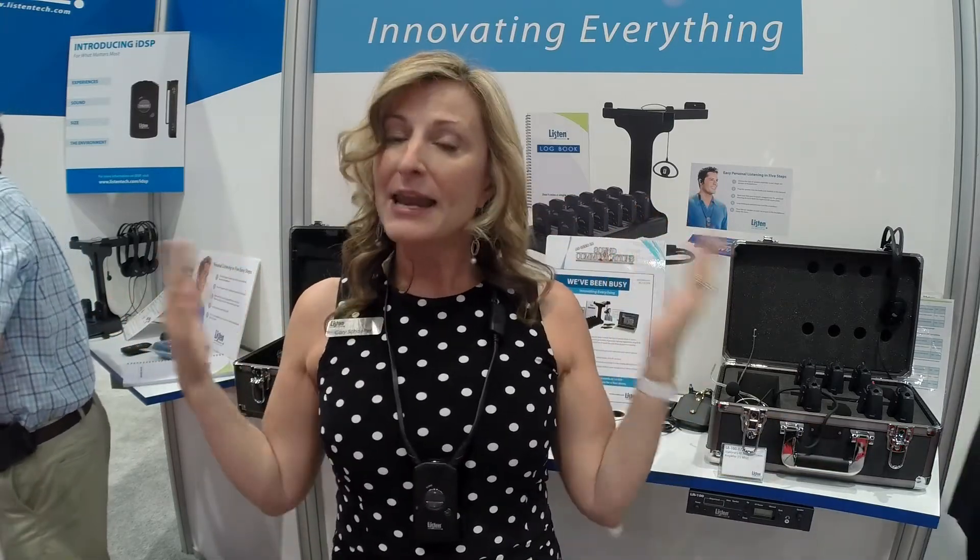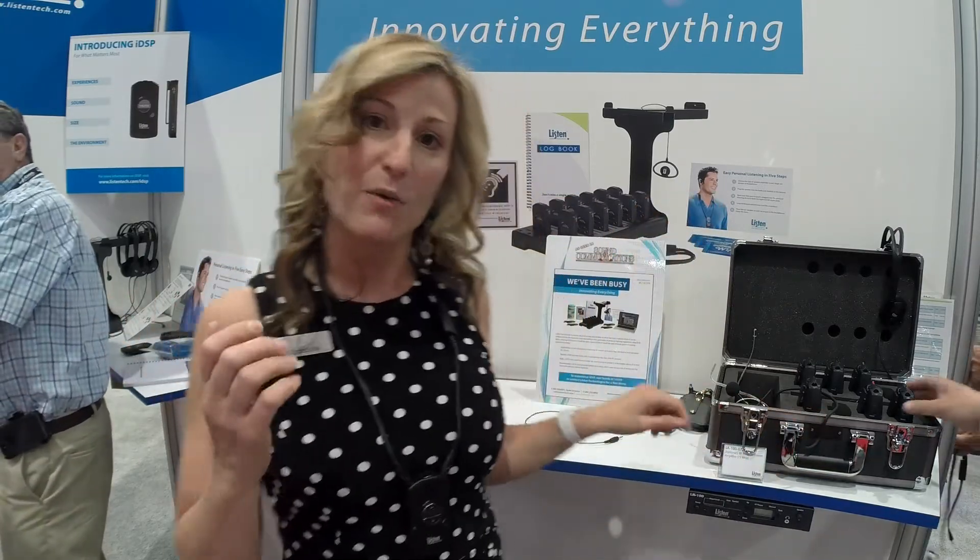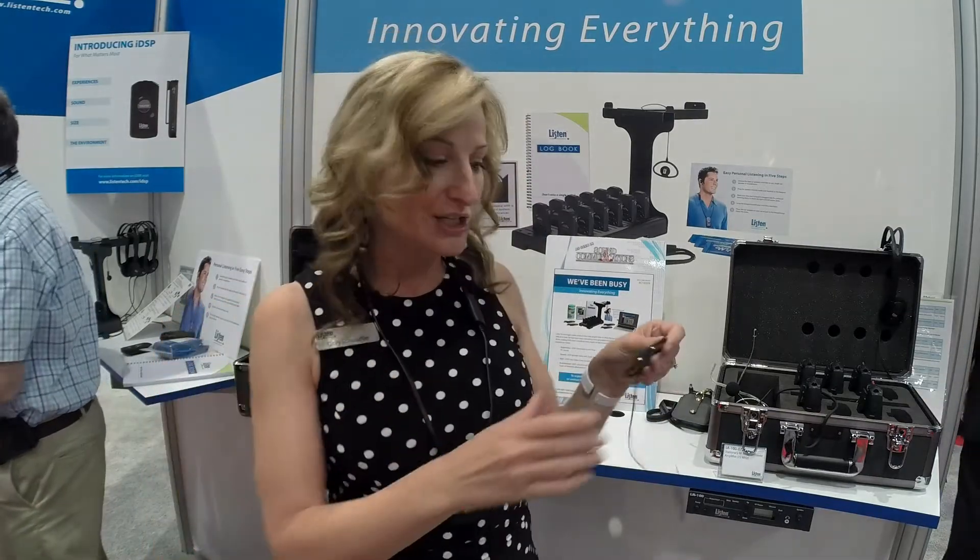Now, if I'm not wearing my hearing aids but I still want to be able to hear this receiver, I just take an earpiece and put that on. There's a little knuckle here that it plugs into, and it does an auto-switch right to the earpiece. Because it's such a short cable, there's no tangling of the cable or anything like that.